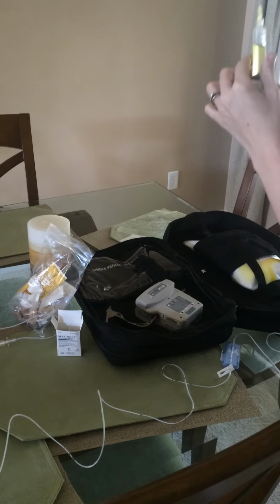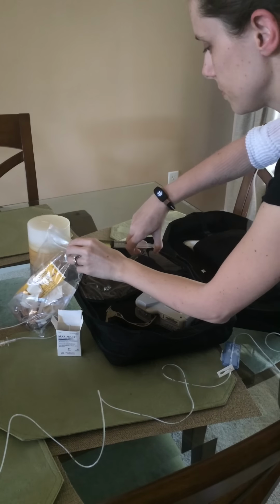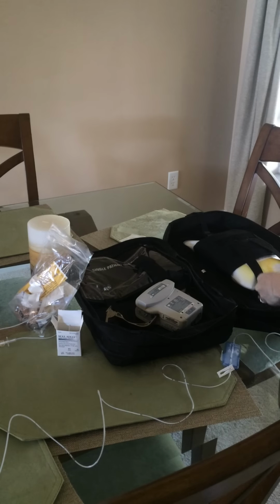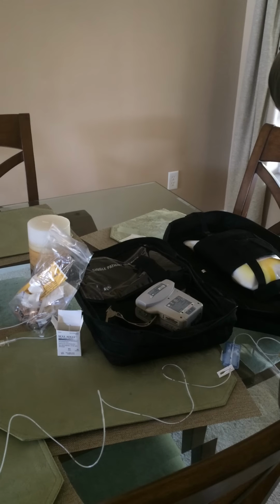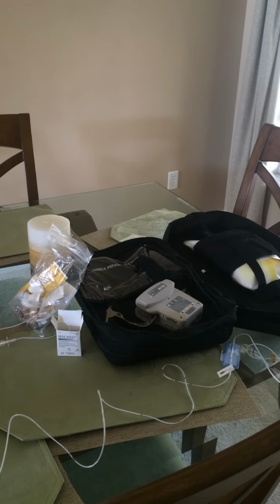I am on the TPN 24/7. As far as how long I will be on it, probably on and off for the rest of my life. Right now, I am on it for at least 6 months. Yay. This book bag gets very heavy. This goes into a sharps container so no one gets stuck. All that fun jazz.